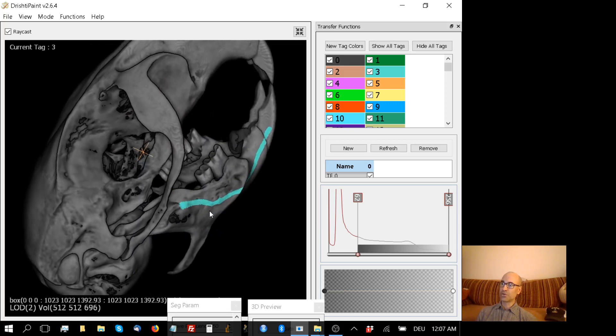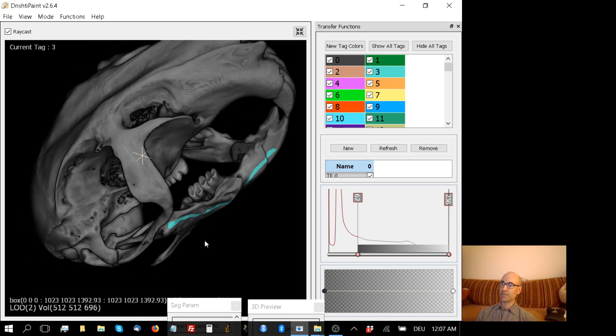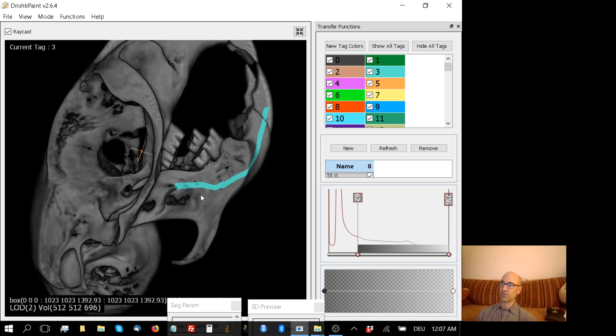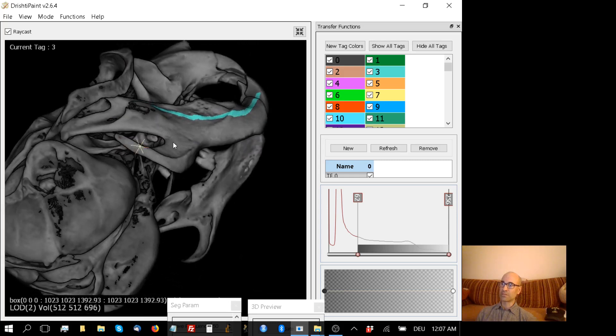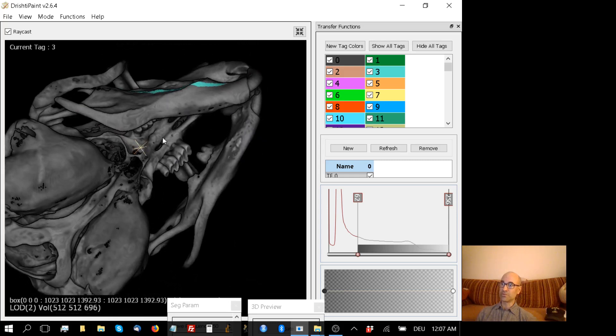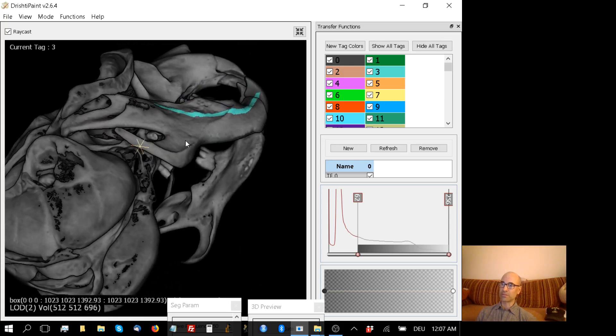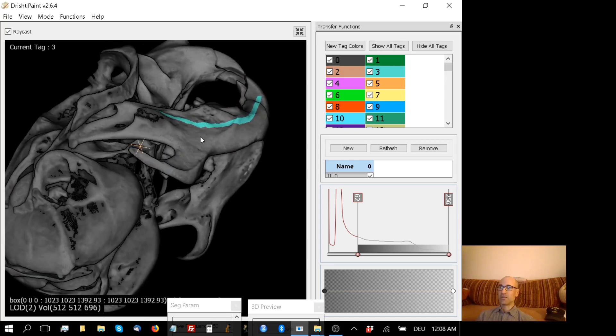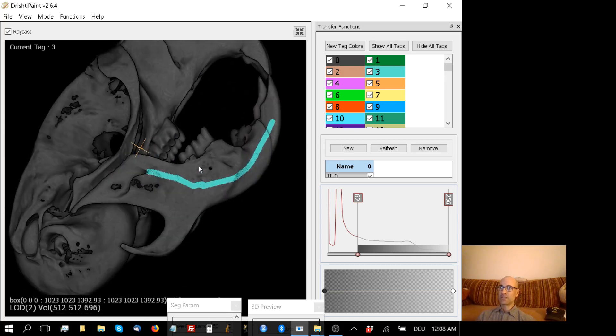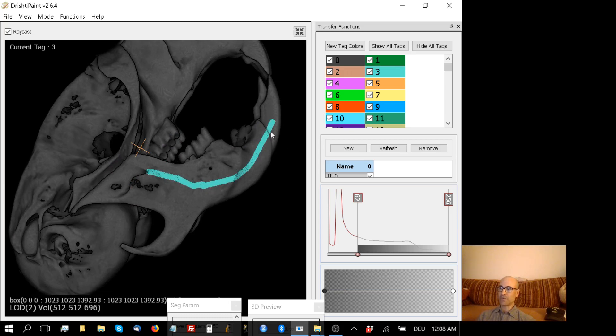Obviously you could do that painstakingly for the whole lower jaw, but no one wants to do that. There is an automated way to do that, and that's by using the F key. This represents F for fill. It's going to fill all the attached pixels, all the continuous pixels, with this tag number 3.